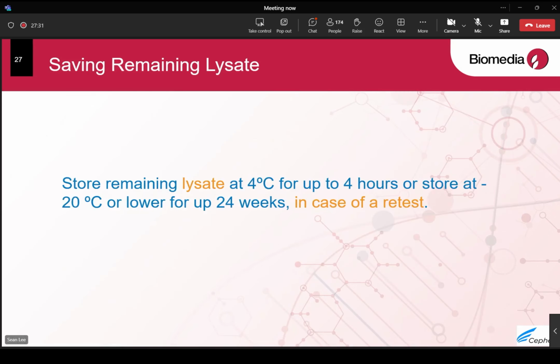Okay, so just now you have prepared lysates. You might not use up all the lysates, so you might have some remaining. You can keep the lysate at 4 degrees Celsius for up to 4 hours, so you have to keep it in the fridge. But if you really don't have time and want to keep it for future use, you keep it at -20 or lower, and you can store it for up to 24 weeks. So it's about 6 months, just in case you need to do a retest. All right.